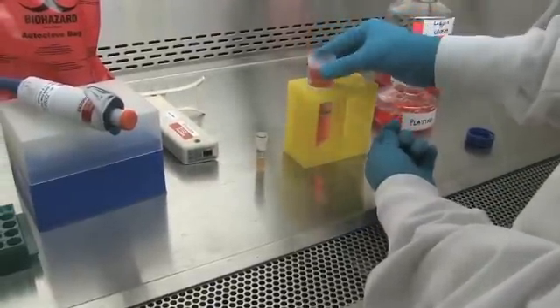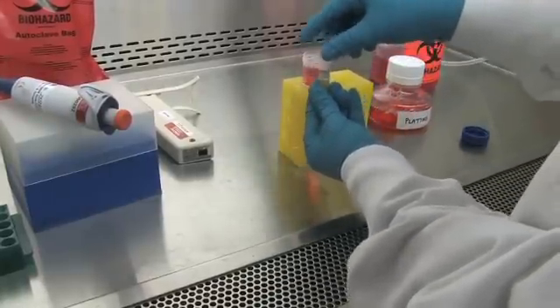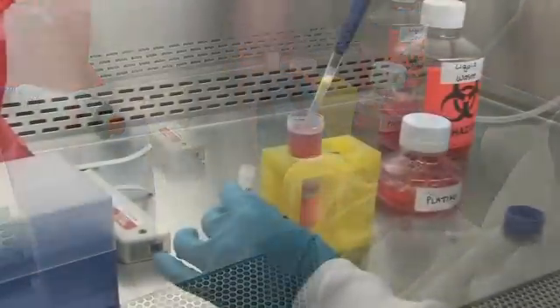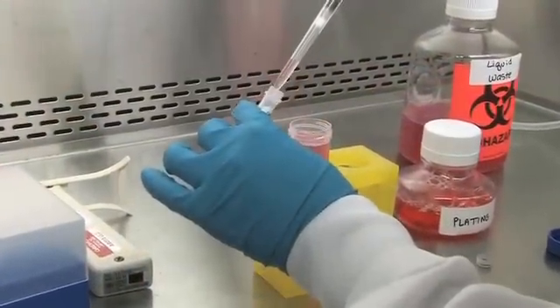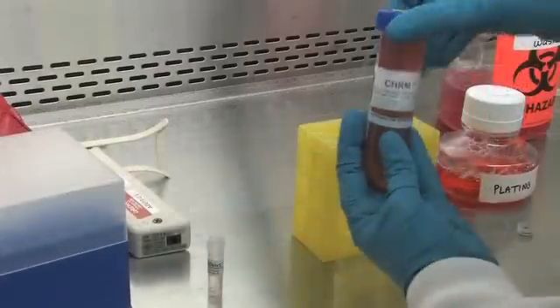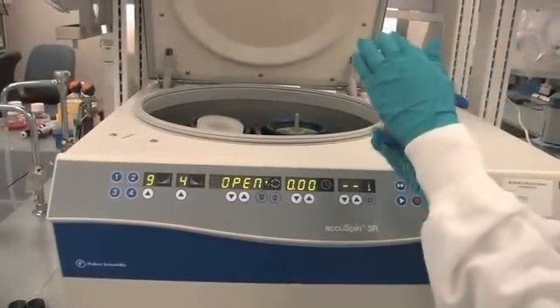Pour the vial contents into the 50 milliliter tube. Rinse the empty vial with a small amount of CHARM using a wide-bore 1 milliliter pipette tip, and then pour back into the 50 milliliter tube. Repeat as needed to ensure the vial is clean. Replace the cap and gently invert the tube at least twice to ensure a homogenous mixture.